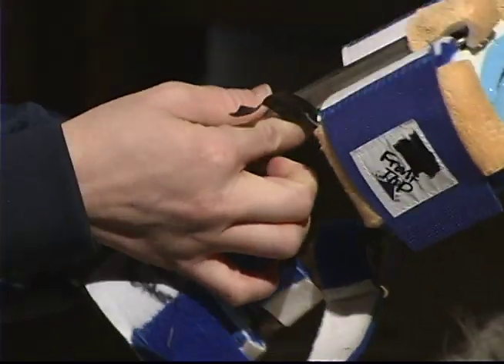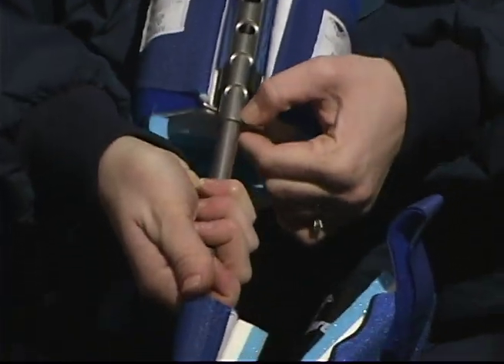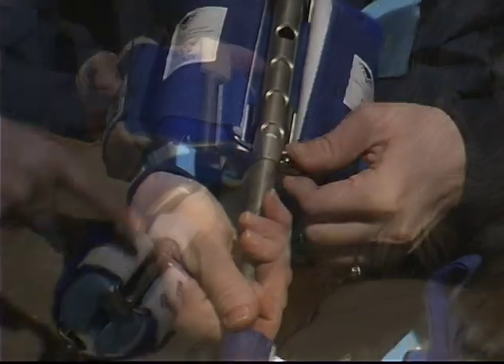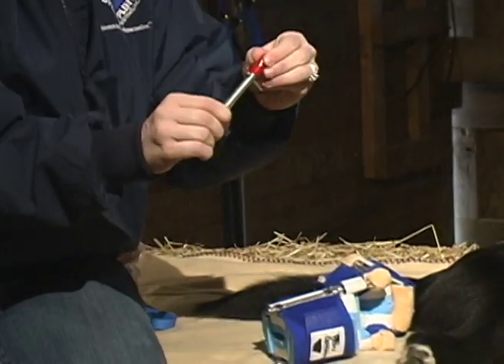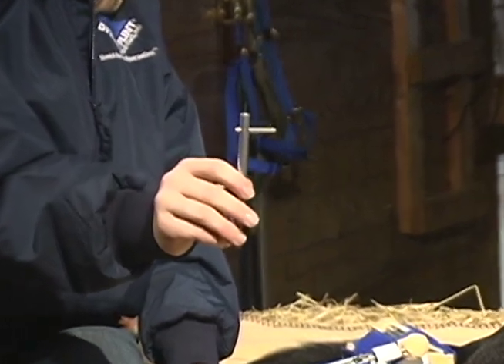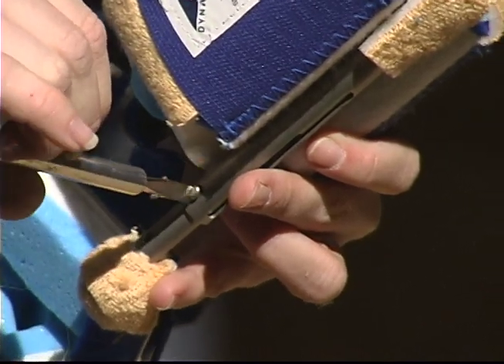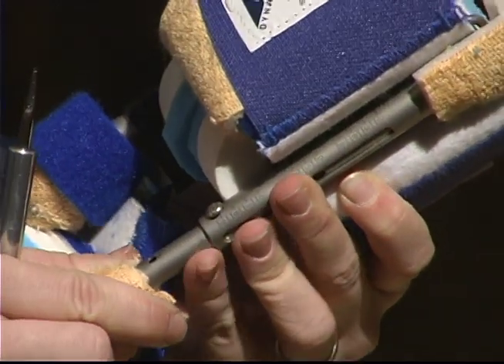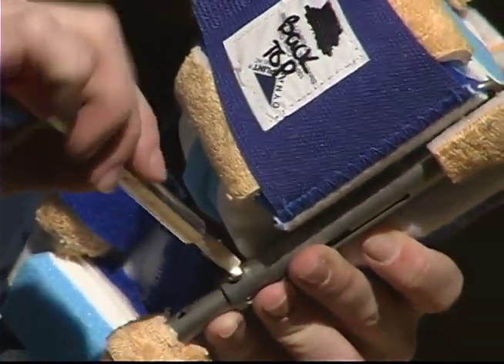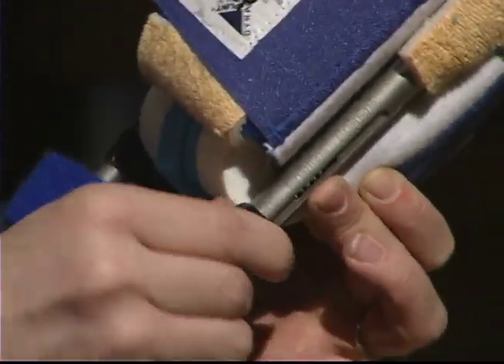To adjust the length of the struts, you will find set screws covered with electrical tape, or a pull pin and lock adjustment on the proximal struts. On the distal struts, you will find allen screws. The adjustment tool has an allen wrench under the red plastic cap. Loosen the set screw with the other end of the adjustment tool — only a few turns are needed so the screw doesn't fall out. Slide the tubes within each other until you have achieved the desired length, then tighten the screw. Using the electrical tape, recover the screw to ensure they do not walk out.